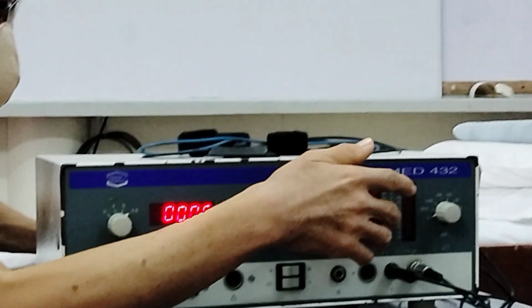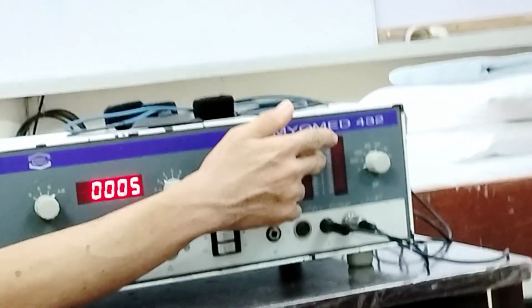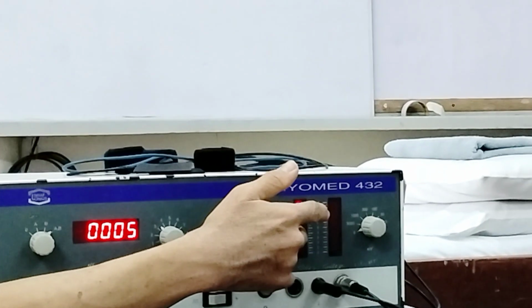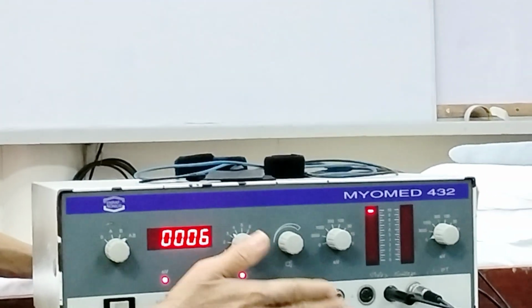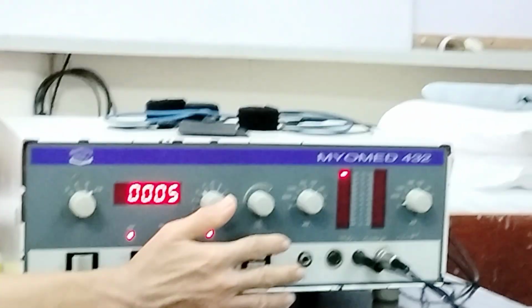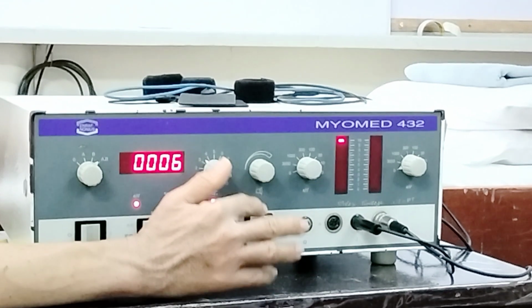You can understand it as a percentage. So it can be like 0, 10, 20, 30 until 100%. Okay. So that means if you place this at 3, and the bar there is at level 10 or 100%, that would indicate that your machine has received at least 3 microvolts of signal. But it can go over 3, it can be equal to 3 or over 3.